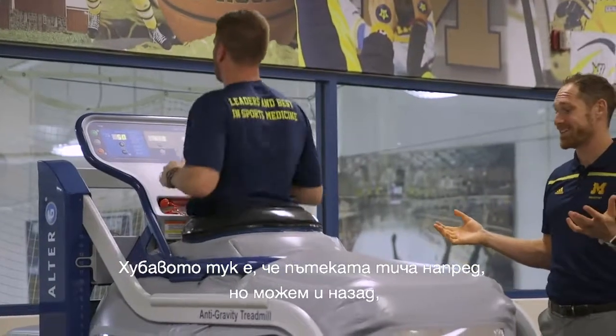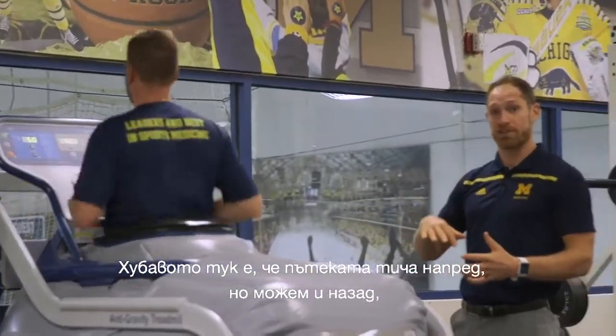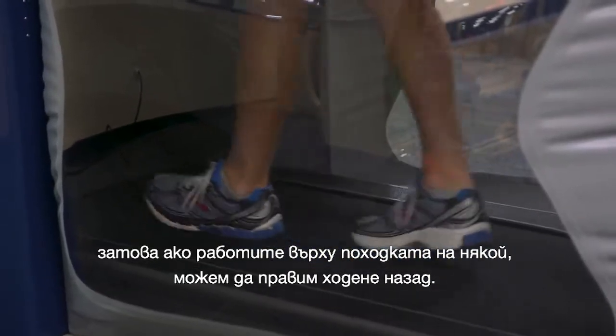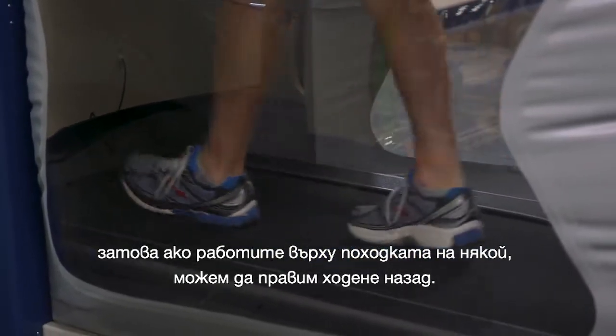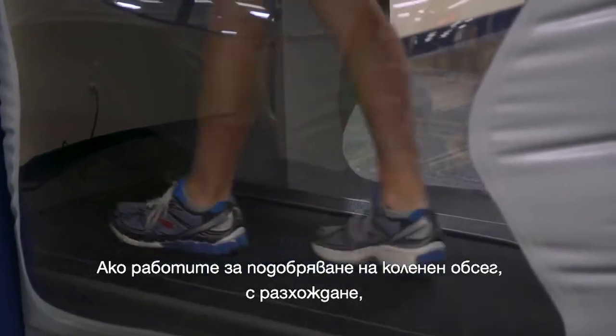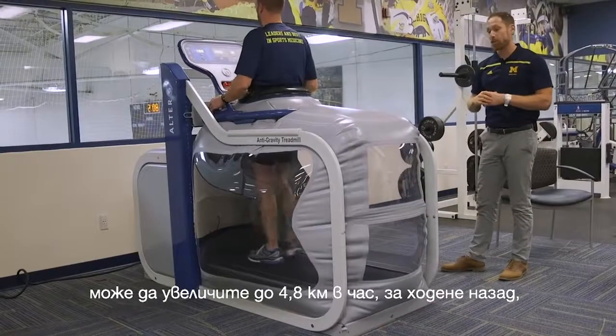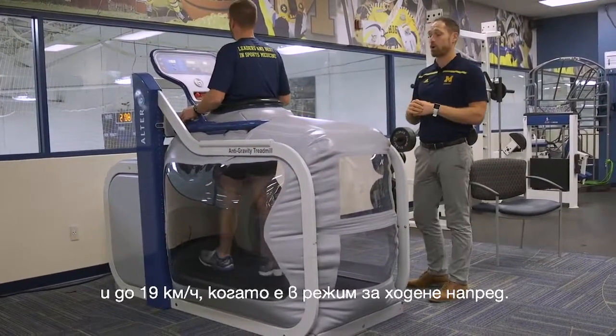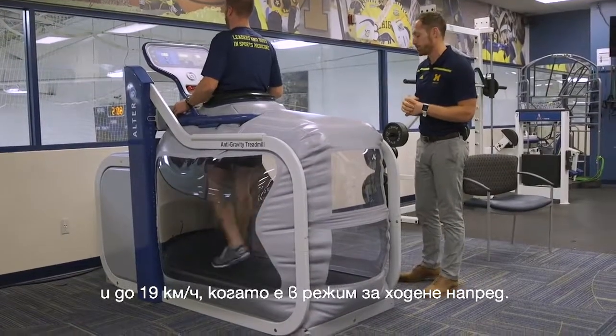The nice thing about this treadmill is it goes forward but we can also do reverse. So if we're working with someone on gait retraining we can do backwards walking — retro walking. If you're working on someone to improve their knee extension with ambulation, it'll go up to three miles per hour for backwards walking, but up to 12 miles per hour in the forward mode.